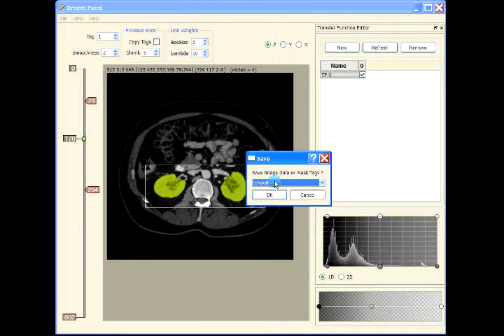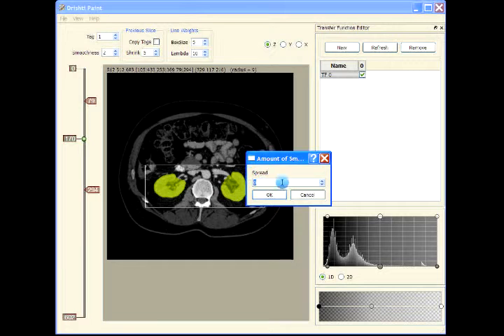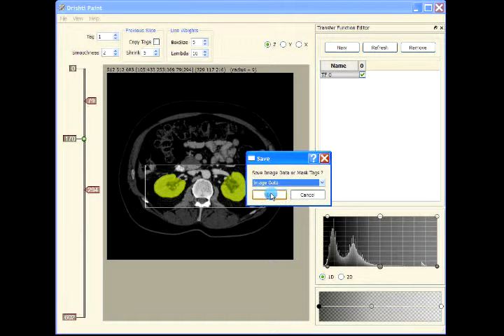Whereas when we press Ctrl+S, Ctrl+D, or Ctrl+E, those operations are performed over the mask data and that data is saved in the mask file, so it is not lost. When we apply any smoothing, dilation, or erosion during saving of the image data or mask tags, that operation is not saved in the mask tags. So right now we are not going to do any dilation, erosion, or smoothing — the spread is zero — and then save the image data.